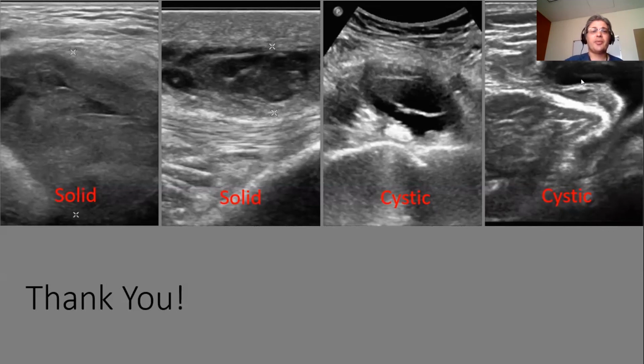Oh, here we go. So how can we differentiate between bicipital radial bursitis and tenosynovitis of the distal biceps tendon? Was that one of the questions? Yes, that's the one. Oh, great.